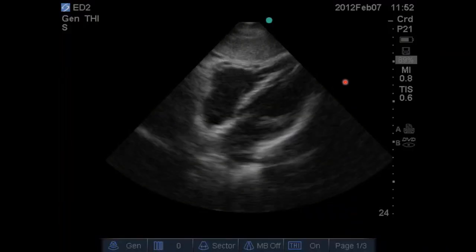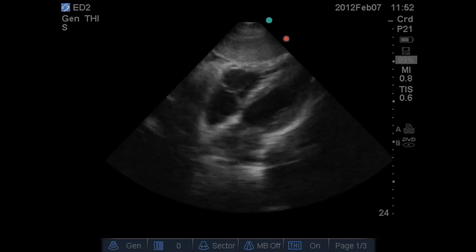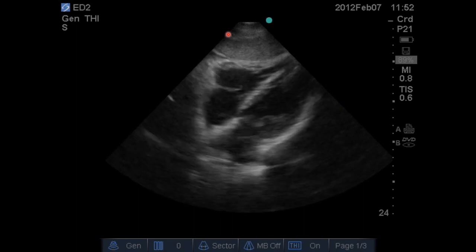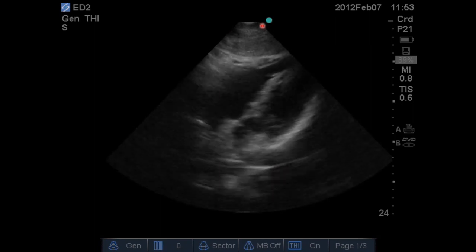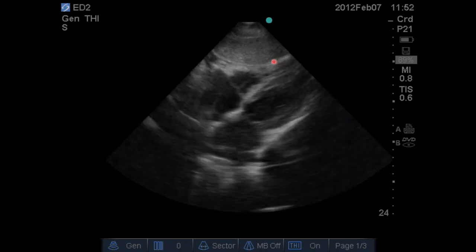This other image that's normal, the heart's beating faster, obviously. And still, let's orientate ourselves to the probe placement at the top here. And we'll find the liver structure right here. Okay, so that's the liver. A little bit smaller, a little bit more compressed than the previous picture we saw, but still normal and still not the main focus. Okay. And here we see the heart.